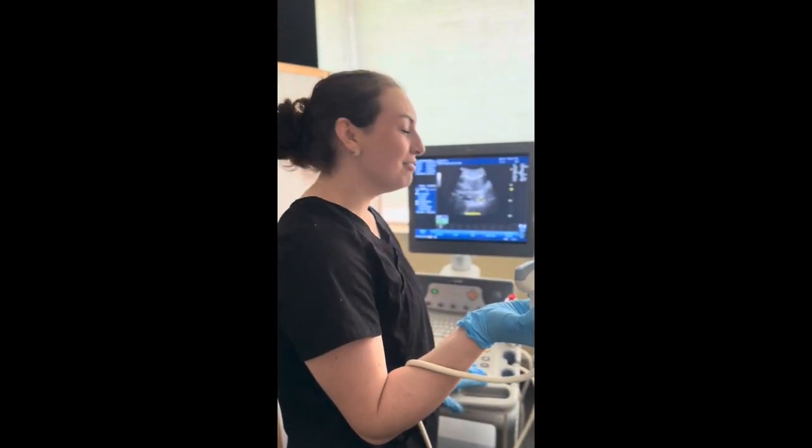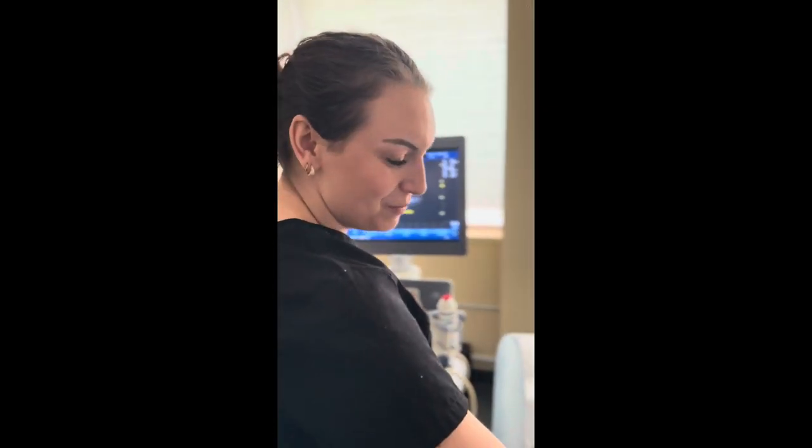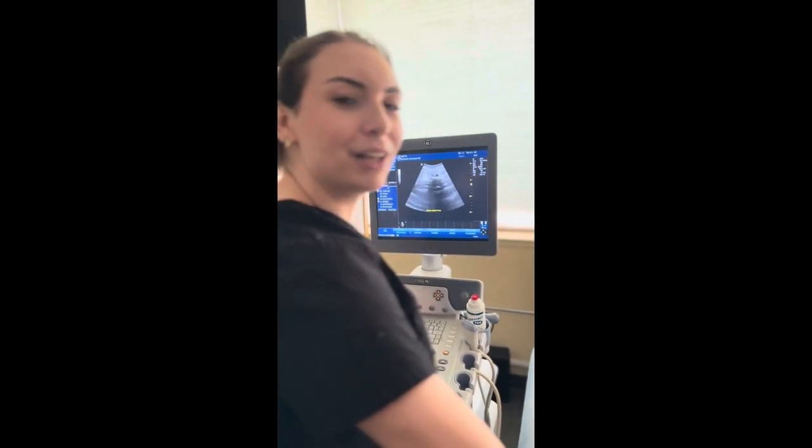Next I'm going to go ahead and unfreeze once again because we're going to work our way down. We just did proximal. Next we would do mid and then distal at the end. The thing we're looking for is to see if there's any abdominal aneurysm. Of course we don't want that, so that's what we're checking for. Anything a bit bigger than 5 centimeters is usually a red flag.